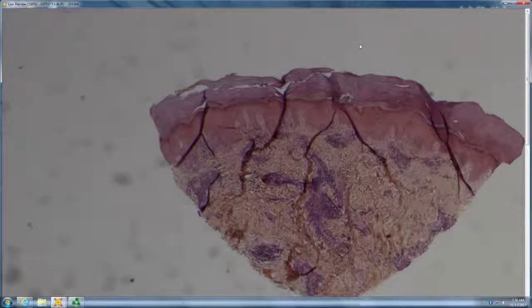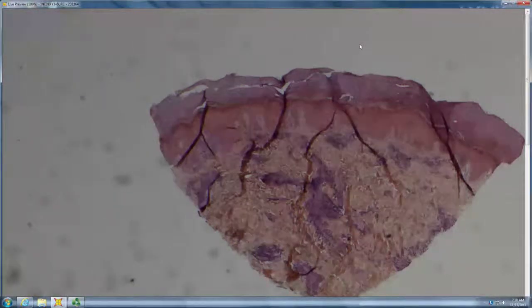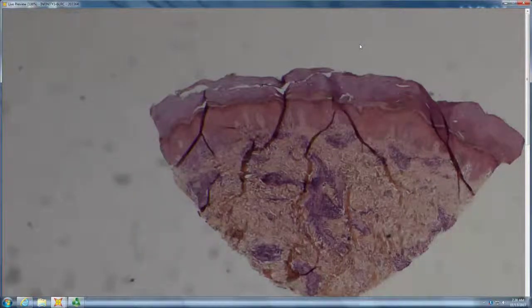So, Shane, where on the body do you think we are? It's acral. It's kind of maybe a little fluffy, superficial. So it's acral, and what you don't have is big papillary dermal edema, which you often get in perniosis. So perniosis is in that differential with Sweet's and polymorphous light, where you get a band of papillary dermal edema often, and if you see that on acral skin, you're pretty much done, it's perniosis.